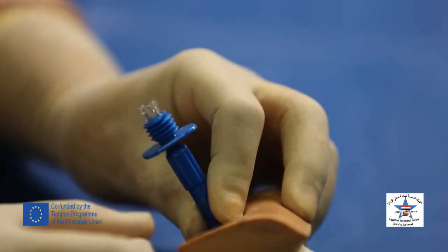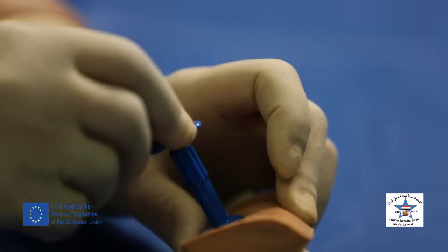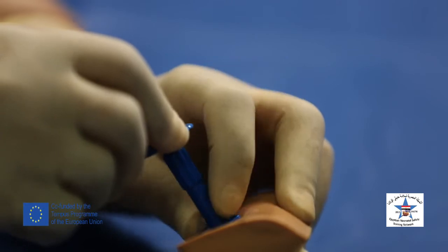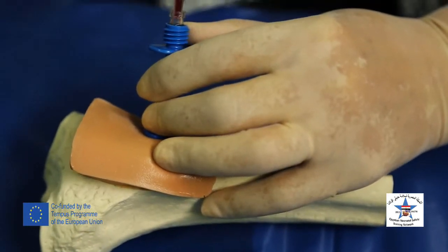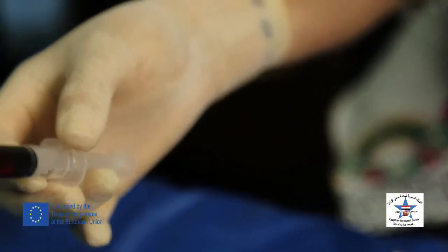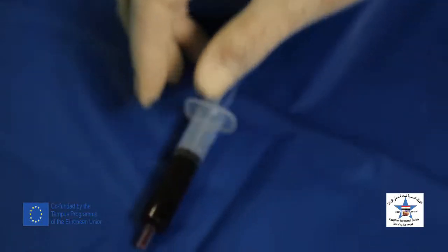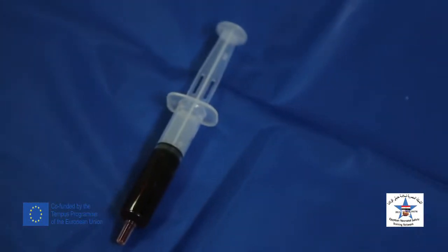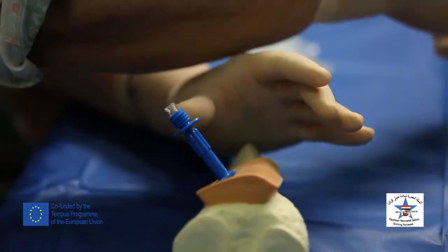How do we know that the needle is in place? The needle stands alone on the bone, it does not move, and we can aspirate blood from the marrow space. This sample will be sent to the lab for investigations, making sure to label the sample as a bone marrow sample in the lab form.